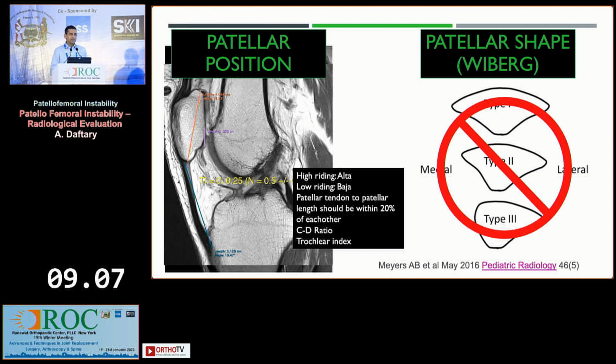I think people are moving away and not talking as much about patellar morphology at this point in time, but that just depends on when people decide to make it in vogue again, and we'll come back to talking about it. But we can look at the morphology and we can talk about those things as well. This is just from the standpoint of craniocaudal patellar position.